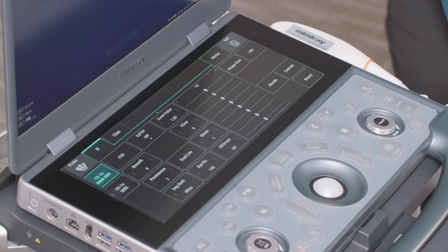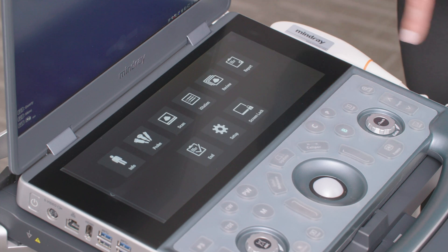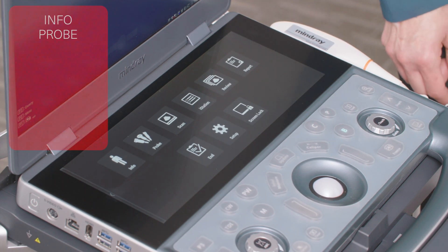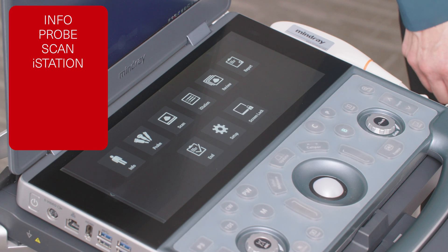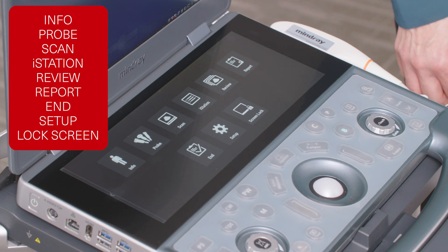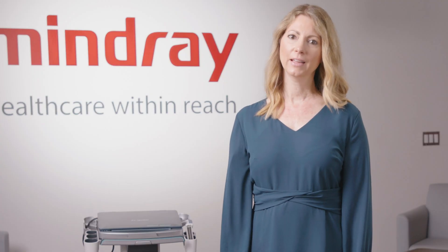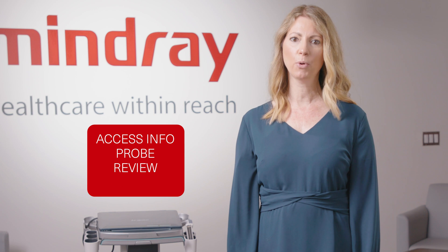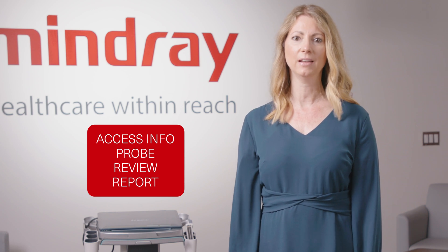Let's review the main menu screen. You can access the main menu screen by swiping from left to right or tapping the arrow on the left of the touch screen. The icons that appear here are Info, Probe, Scan, iStation, Review, Report, End, Setup, and Lock Screen. In later software versions, Access Info, Probe, Review, and Report will appear on the left side of the touch screen.